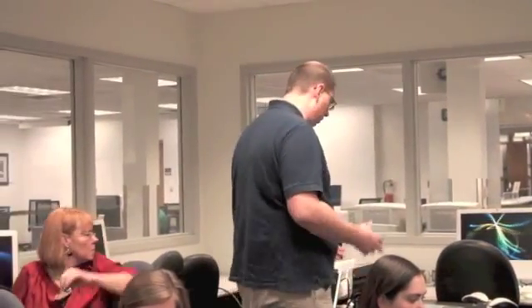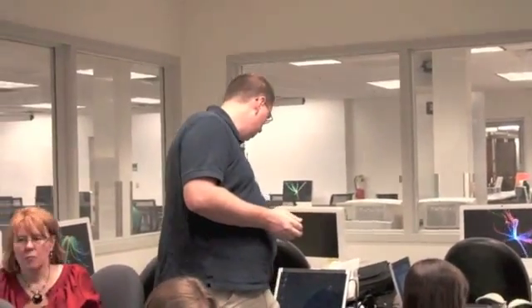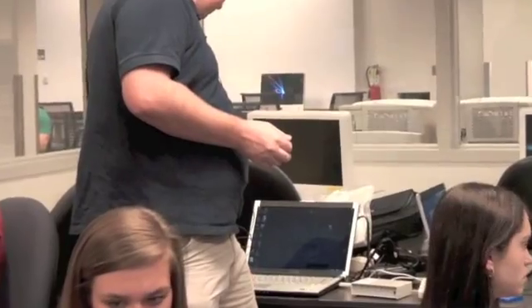Software-wise, another thing we're going to look at is switch access for computers. If somebody has some good motions but is limited in their mobility, then we may want to look at switch access for a computer. Basically, it's switches, guys. If you put it under the technology, it's called switches.